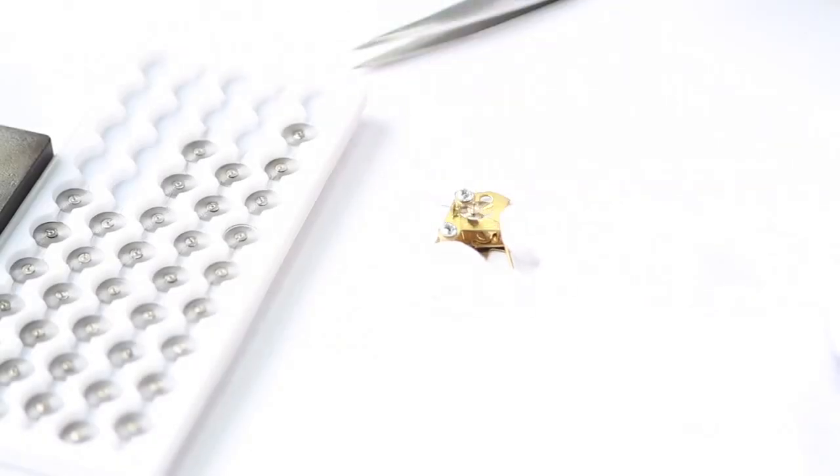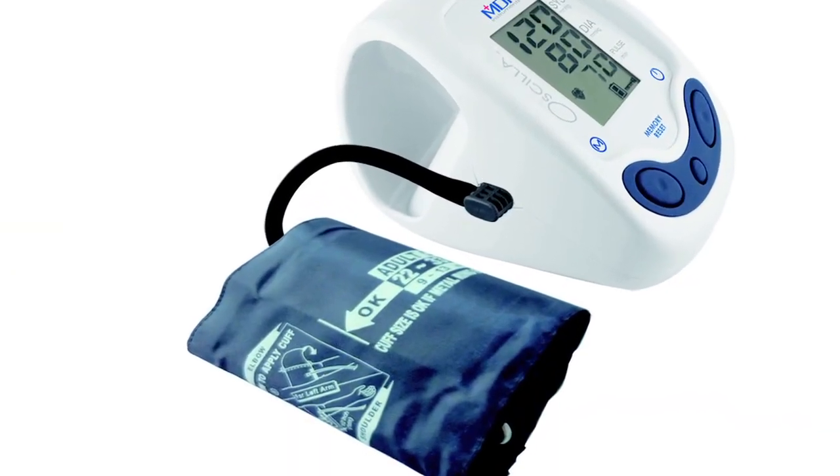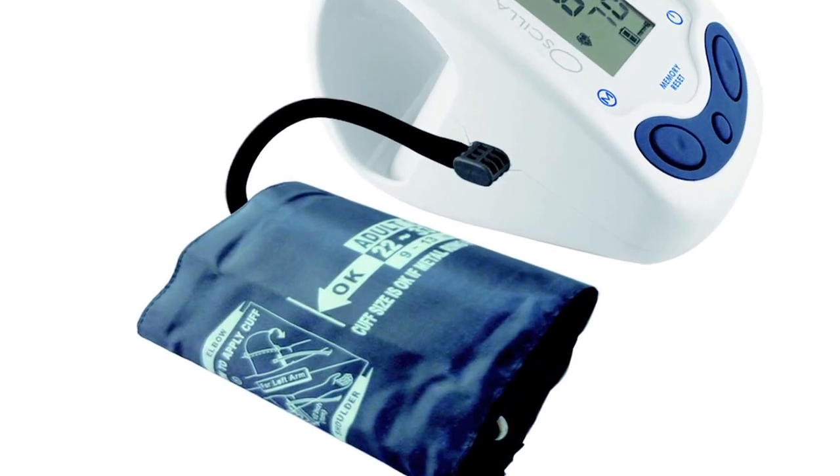That was the key — and really just the starting point, the basics. We incorporated our inflate-read technology, unique to us, which captures the entire reading on the inflation and is 40% faster than traditional devices, making the reading more accurate and quicker.